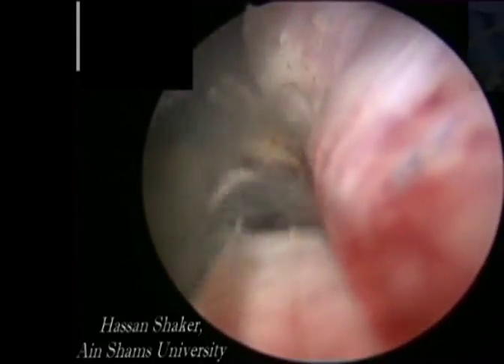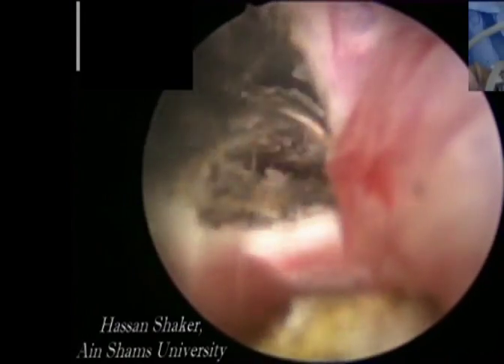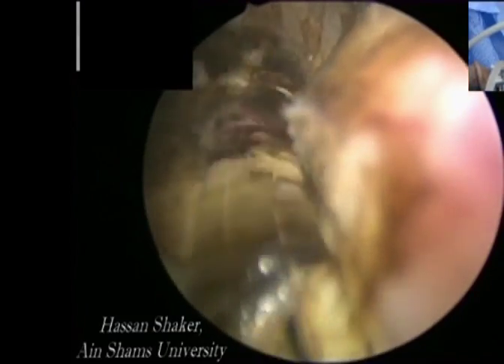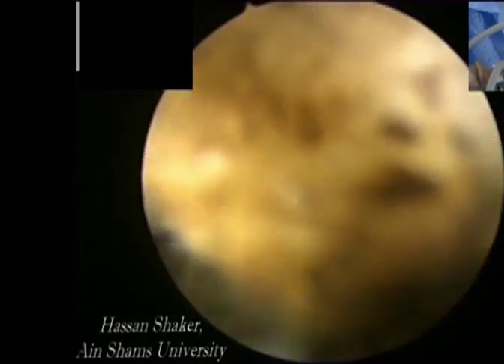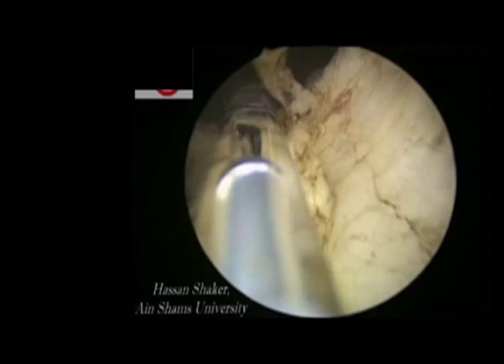Notice the surgeon's hand in controlling the fiber. In this view, the bladder neck fibers are well seen.